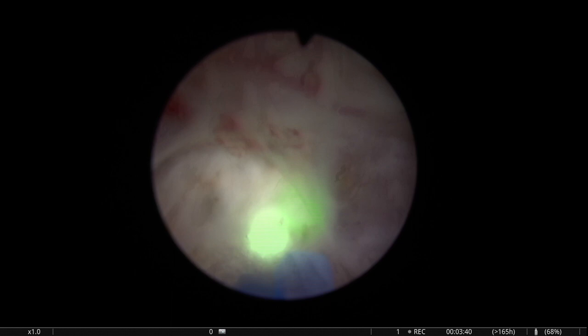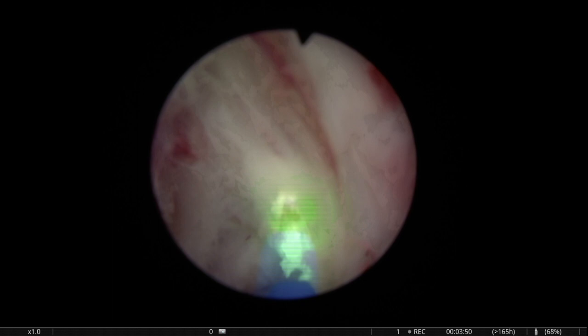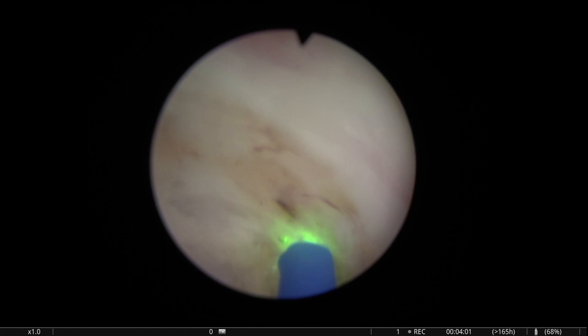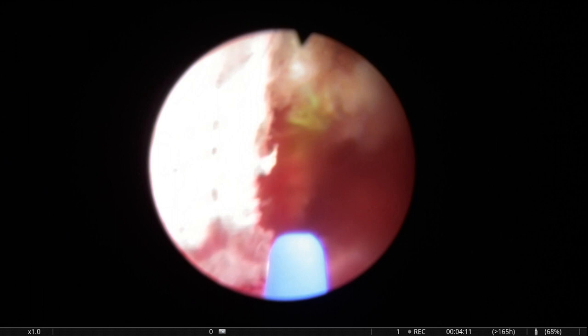So here, the entry into the plane has been made. The connection between both planes has been made by cutting the tissue above the midline. And you see this white line has the role of protecting the sphincter, and especially the sphincter's mucosa. We will get a nice view at the end of how the sphincter was at the end.